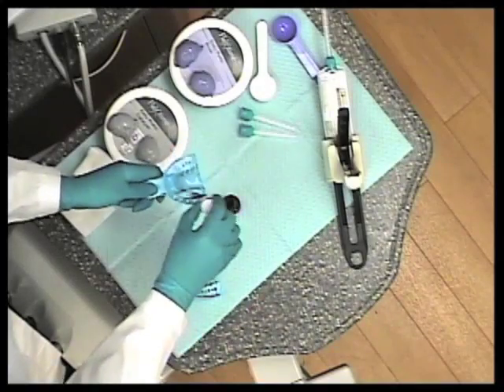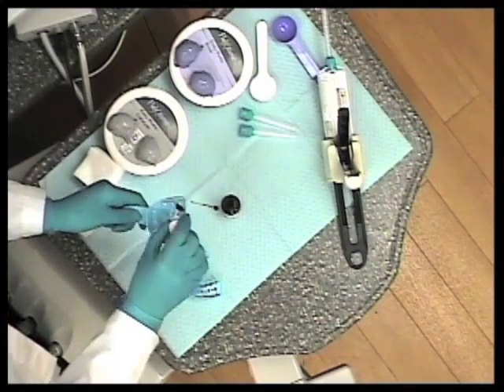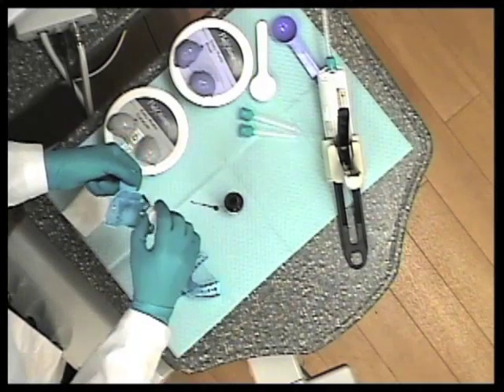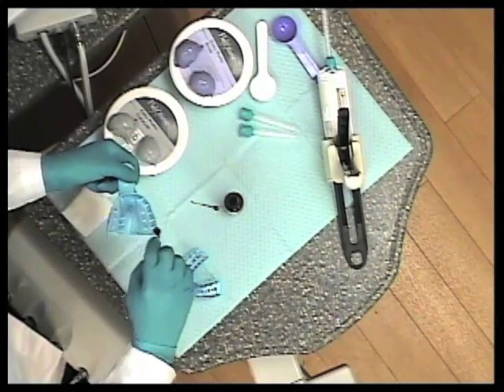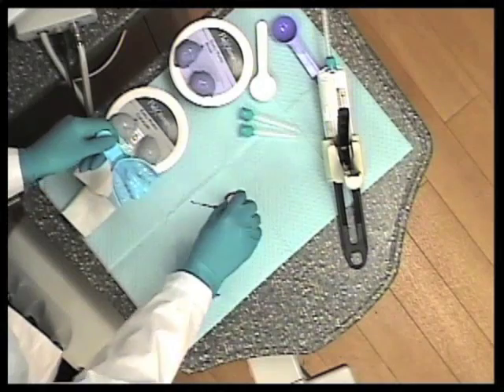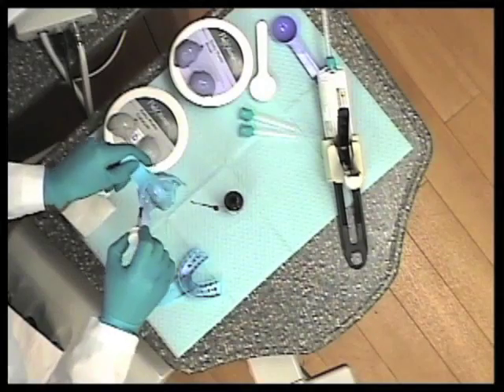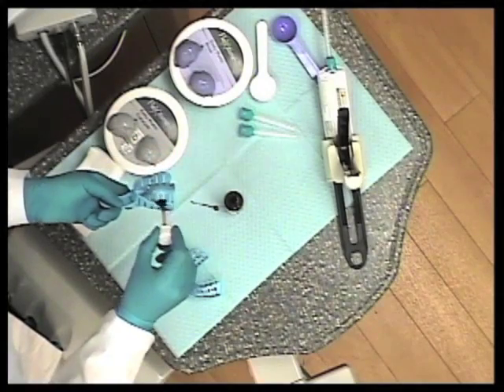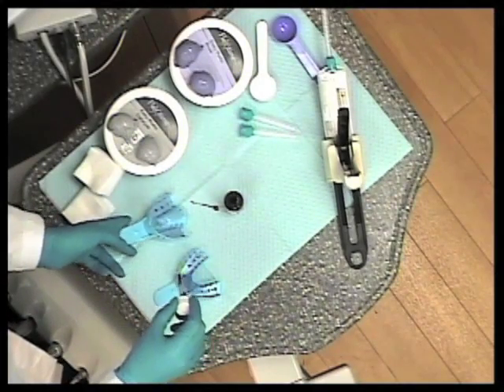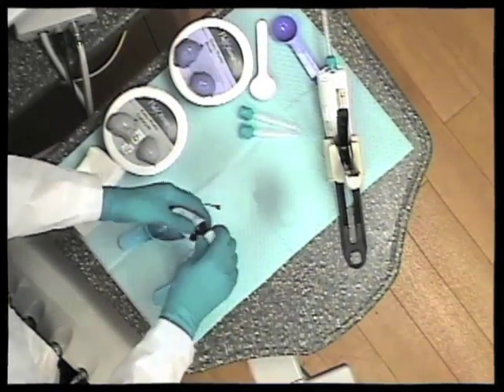And so the great thing about a polyvinyl is it can be poured multiple times. And so there's no need to have the additional chair time of taking 4 impressions. You can just take 2 really good impressions, and I think you're going to find out in the end you're going to come out ahead. You're also going to see with this technique, because the putty displaces tissue so well, that you really get very well extended impressions, and you're not going to have to remake or retake impressions very often following this technique.